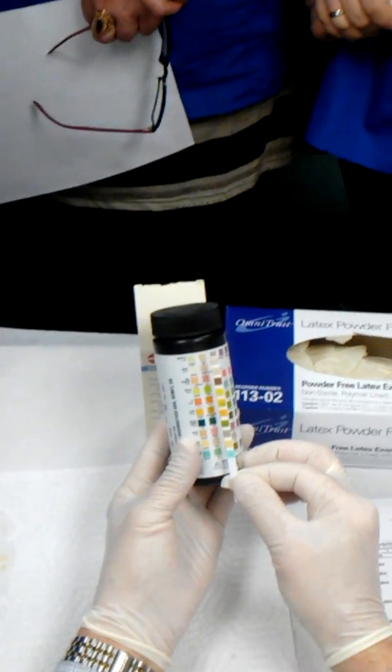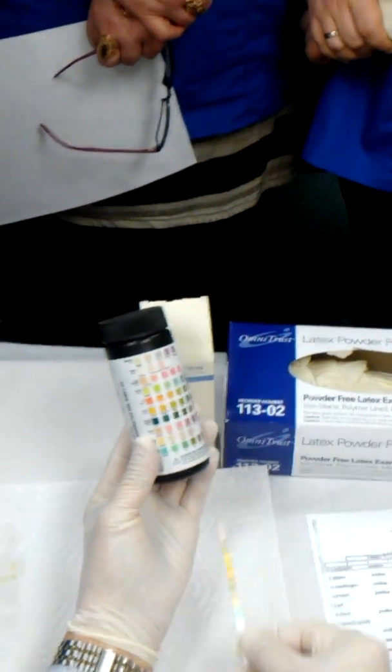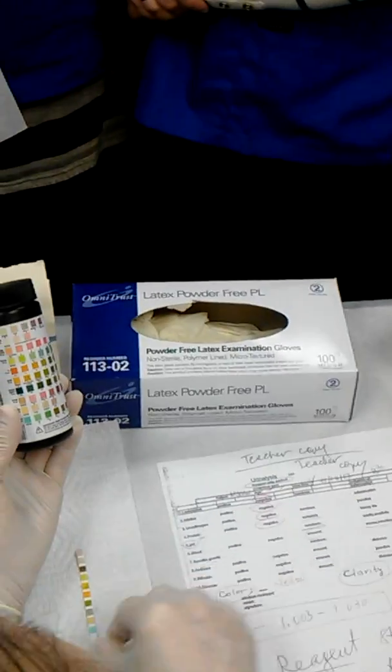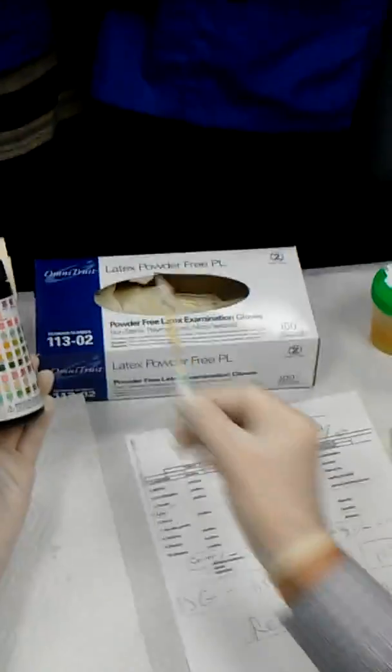Next is protein. Protein is this one, number 4, right? You see it's negative. So you write negative. Protein is negative. Next is pH. pH should be numbers, I told you. So it's number 5: 1, 2, 3, 4, 5.